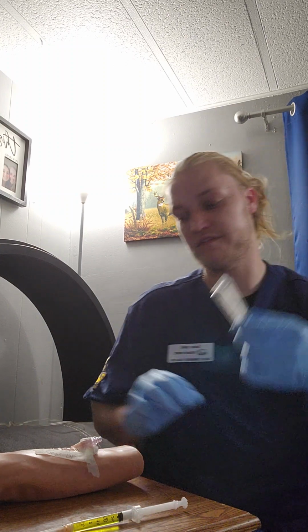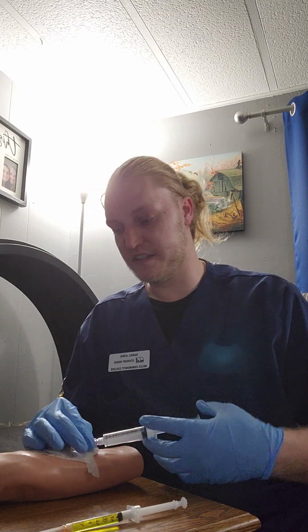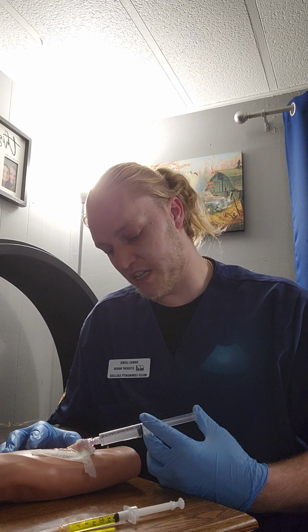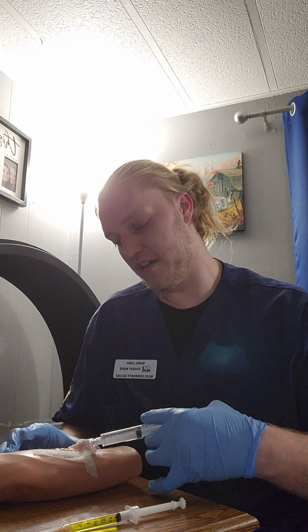And here I would have just a 5 ml saline flush, but I have a 10 ml, so instead of having 2 of them, I'm just going to do half now and half at the end. So I'm going to go ahead and connect this, and I'm going to go ahead and flush this. The reason I'm doing this is to make sure that the IV site is still patent.